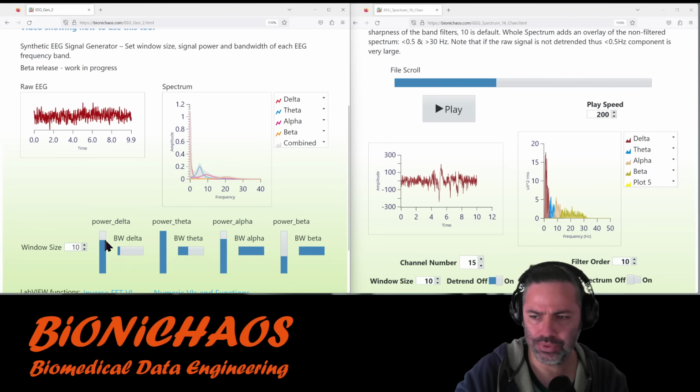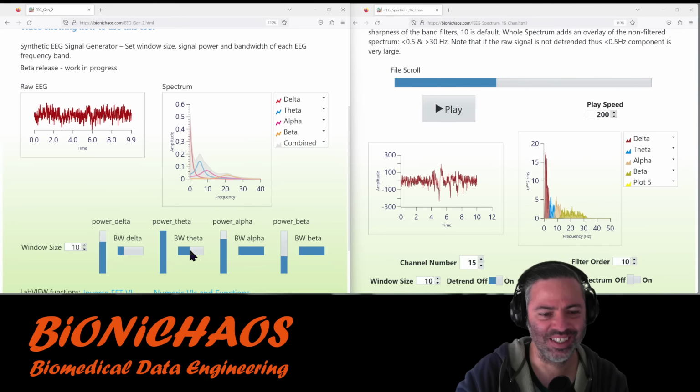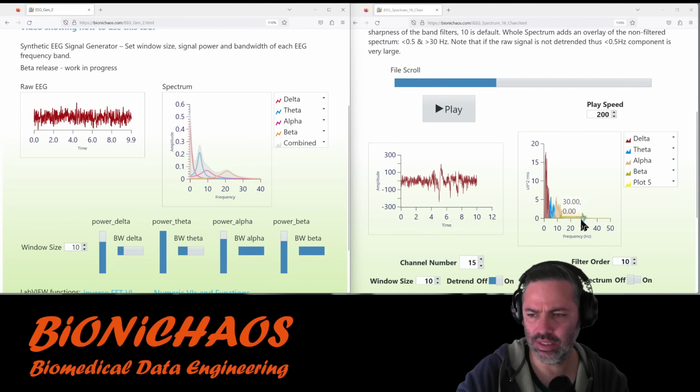I don't know why people say, oh, but it's visual, your eyes are wrong. Well, no, they are correct. It's as good as it gets. So you can do this and try and replicate this type of shape.